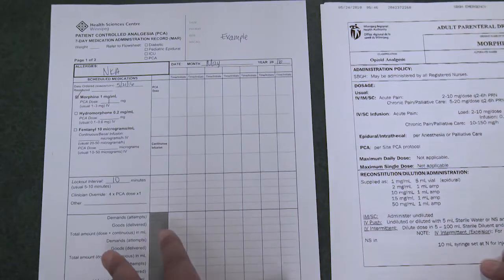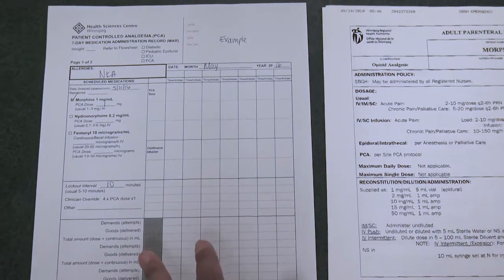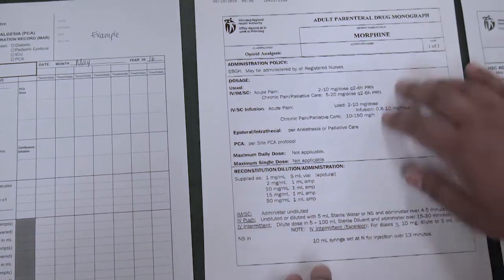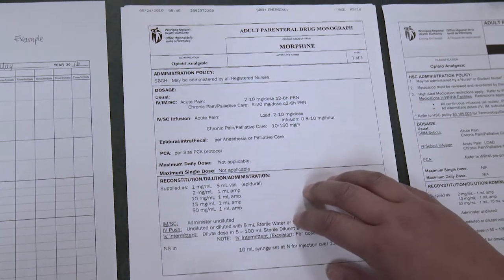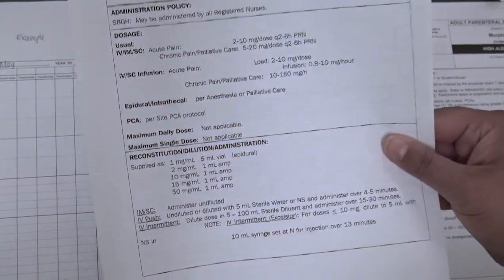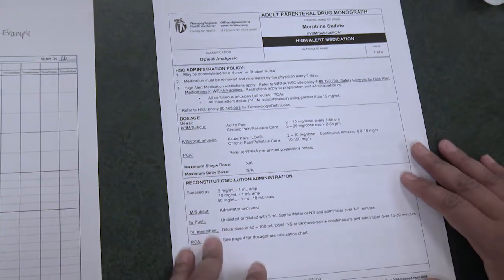Now that you have your MAR and you've checked it with your physician's order, we can go to the med room and take a look at your monographs. Just be aware that for St. Boniface, the Curlin pumps have a separate monograph, so make sure that you're using the right monograph for reconstituting. This is the one for St. Boniface. However, I'm going to be using this one, which is also WRHA, Regional Health Authority.